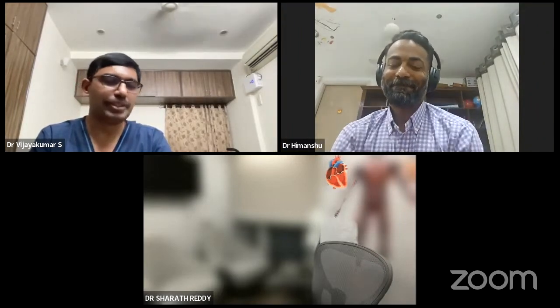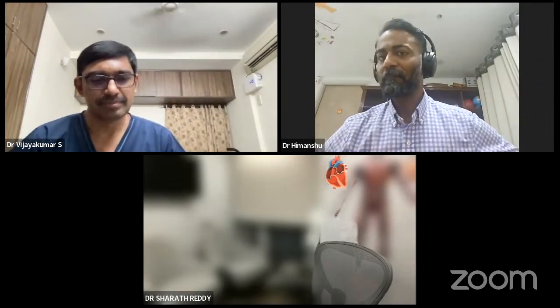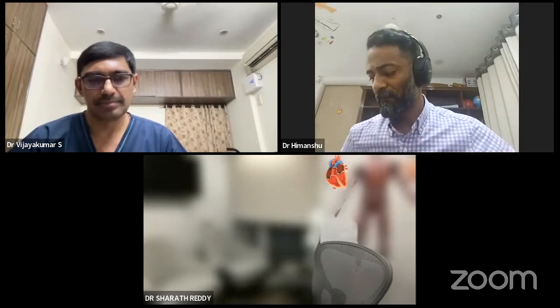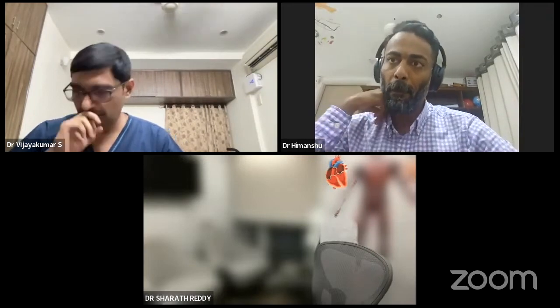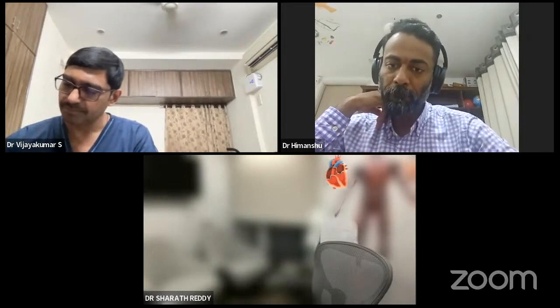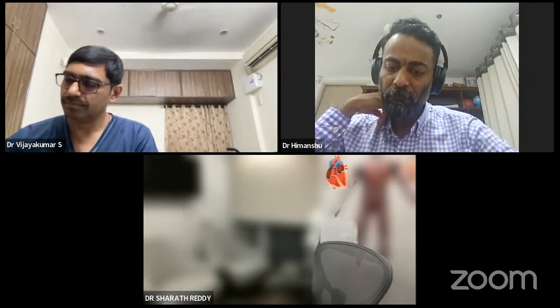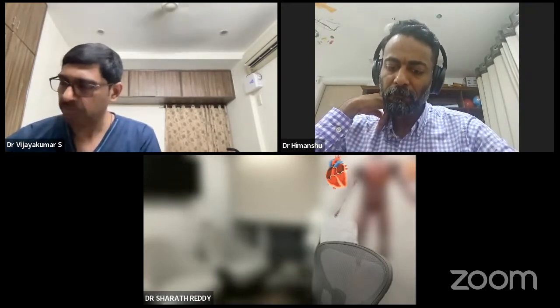Thank you, Himanshu and Vijay, for the nice comments. And the most important thing, one thing which is very important, is the safety of the procedure. And that is paramount in such patients. Without considering all safety points, it's very difficult to really take these patients into the cath lab.